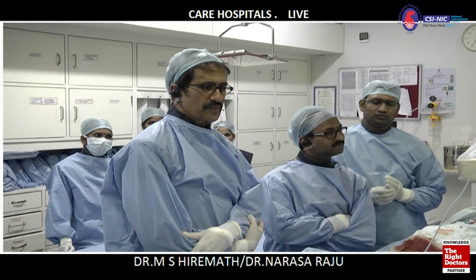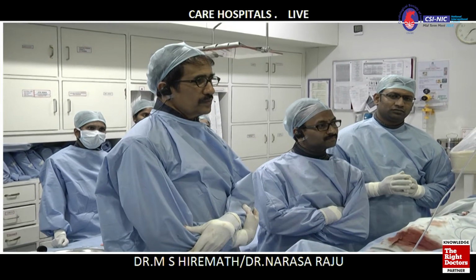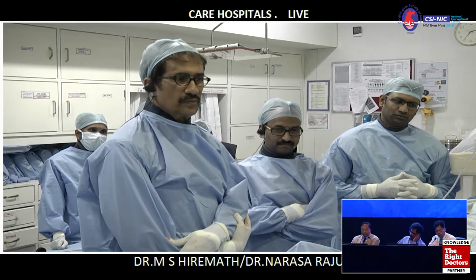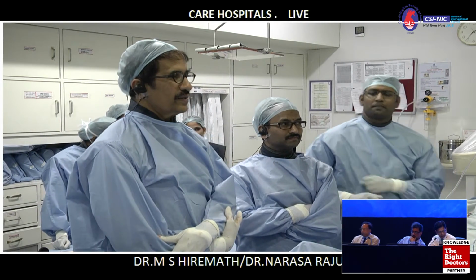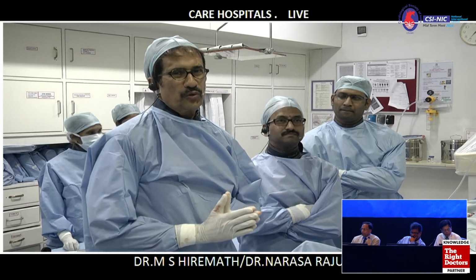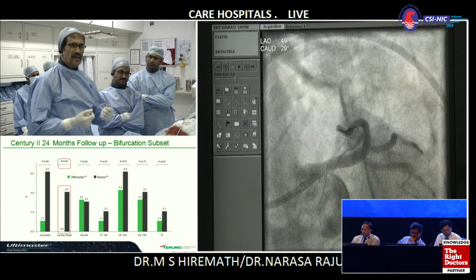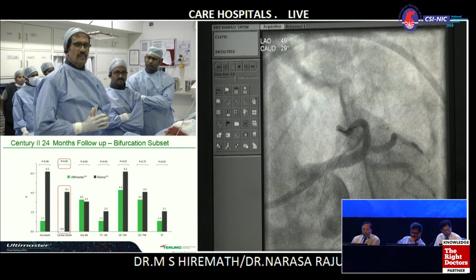You know, our centers always run short of hardware. You said that if you do not have more than 4 balloons, then we'll put another wire and another balloon and dilate. Does it cause an elliptical shape of the stent? What is your experience? No, I don't do it. Most of the time, as we're discussing, we do a 4.0 stretch. If this had not stretched, I would have taken a compliant 4.0 balloon and stretched it. Two balloons together in a hugging fashion, I don't know whether it will lead to some kind of stent deformation, but that's one of the options.